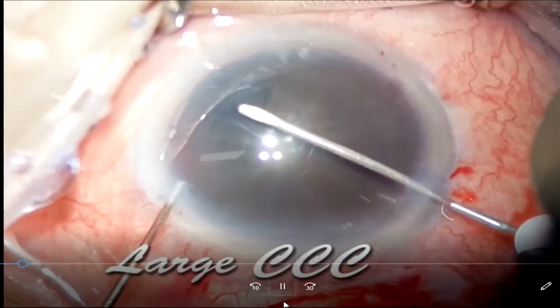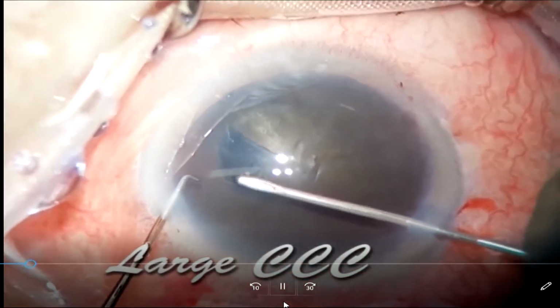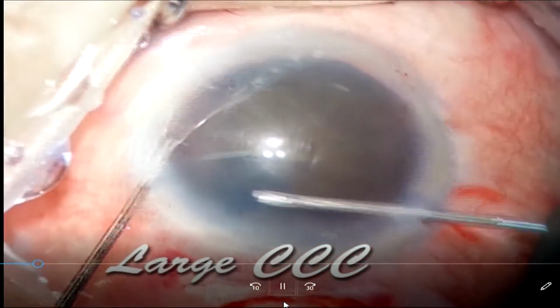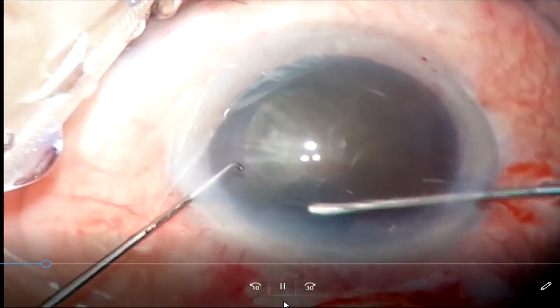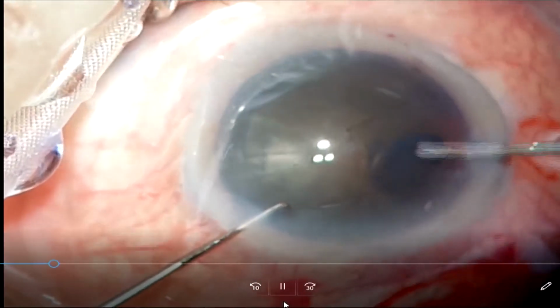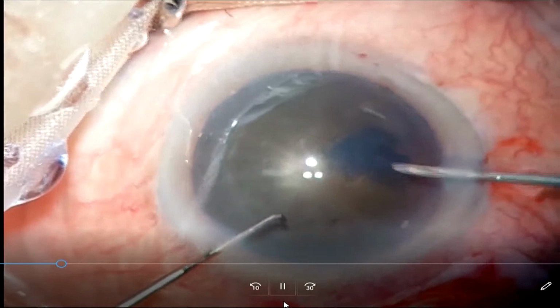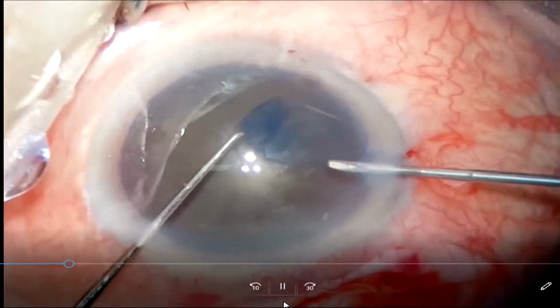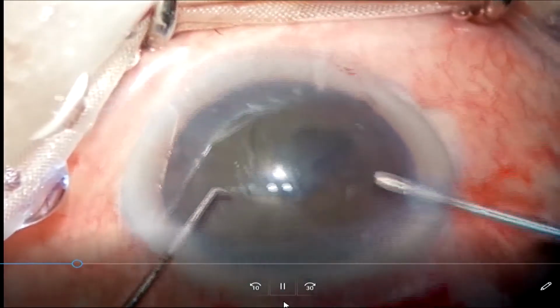Now remember, the size of the rhexis corresponds to the size of your nucleus. If you have a nucleus which is very large, don't try to make a small rhexis. By and large, your rhexis size has to be 6 millimeter or larger in SICS, but if it is a very large nucleus and you make a small rhexis, you will end up doing an intracapsular cataract extraction. If by chance you have ended up creating a small rhexis, you need to enlarge it further before you go in for prolapsing the nucleus into the chamber by giving 2 tangential cuts.